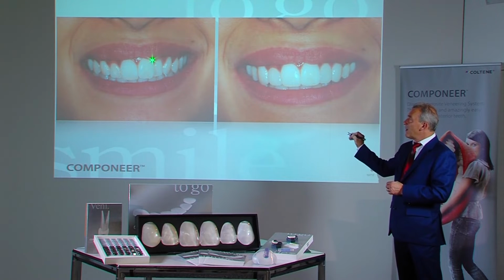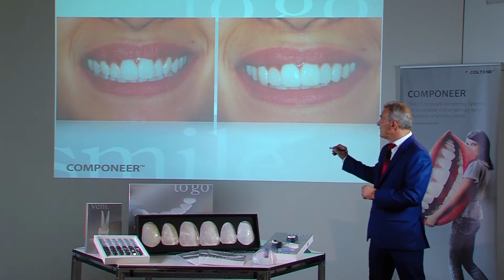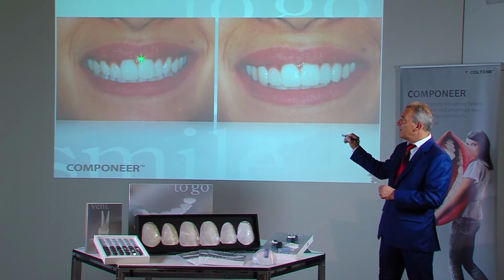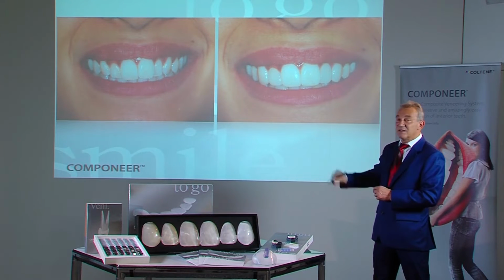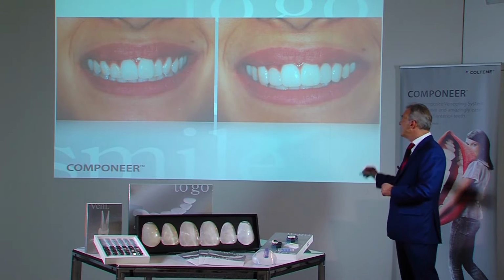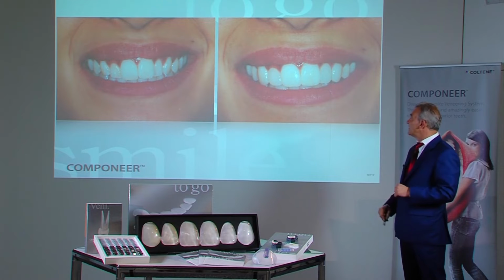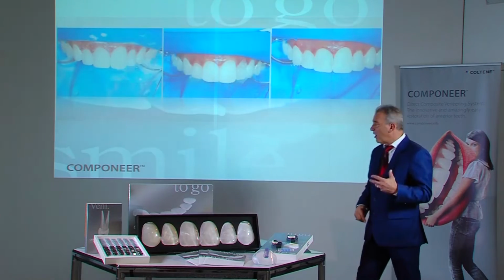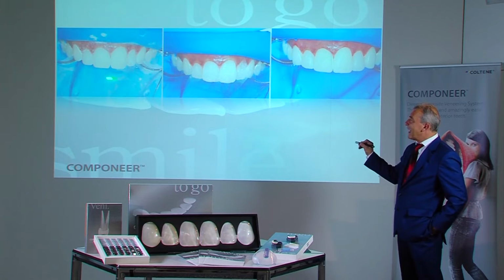One can see that the middle incisor lacks contour somewhat distally. We can see the step in the gingiva. The tooth is somewhat retarded. This means that both incisors need to be brought to the same length. We can illustrate this with the diagnosis. A bit is added distally and here at the incisal edge, and the two twos are built up buccally. And with that, preparation is completed.